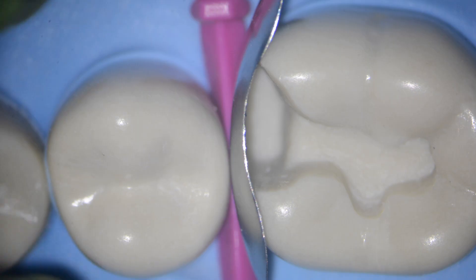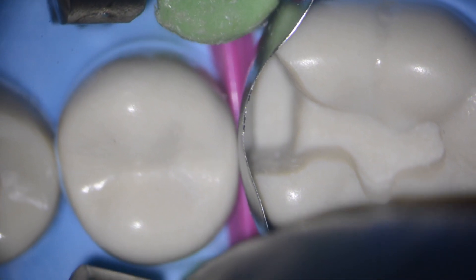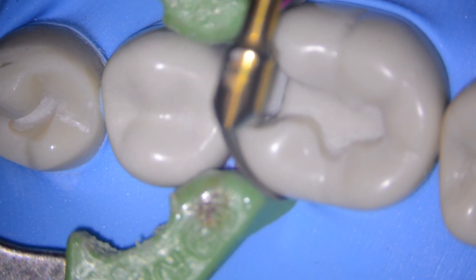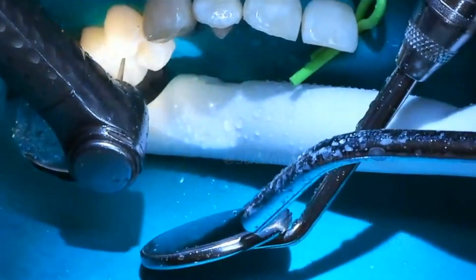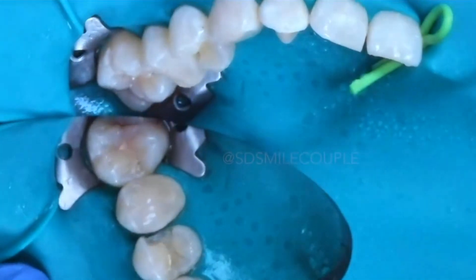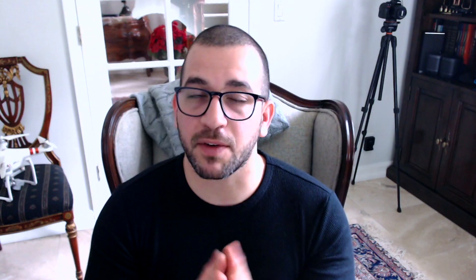Back to the sectional matrix — notice how the ring creates a slight separation between the teeth to compensate for the thickness of the matrix. I always burnish the band with a small condenser or with a flat-ended instrument to make sure I'm getting the best contact possible. Sometimes, even before putting my setup on, I'll recontour the adjacent tooth with a flame-shaped diamond to make sure I have the contours where I need them so that I can achieve a tight contact. I really believe in that because I don't want my patients to get food caught in between their teeth and possibly have the formation of a new cavity.